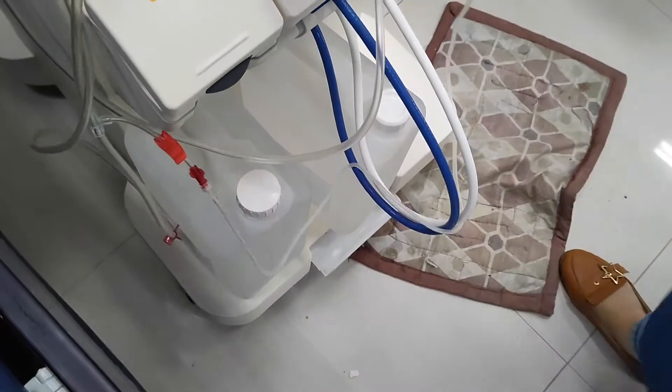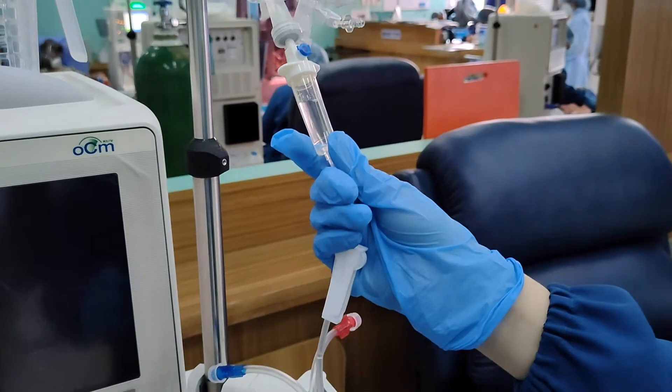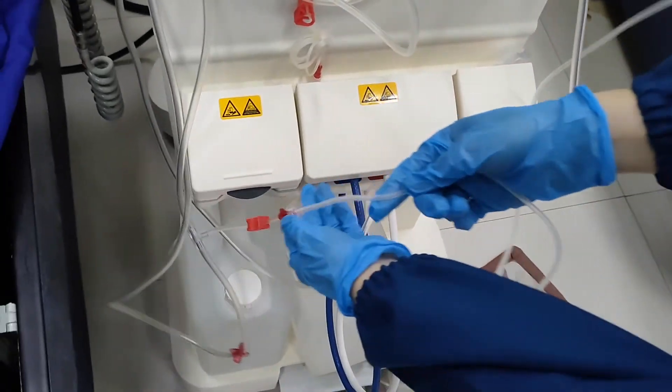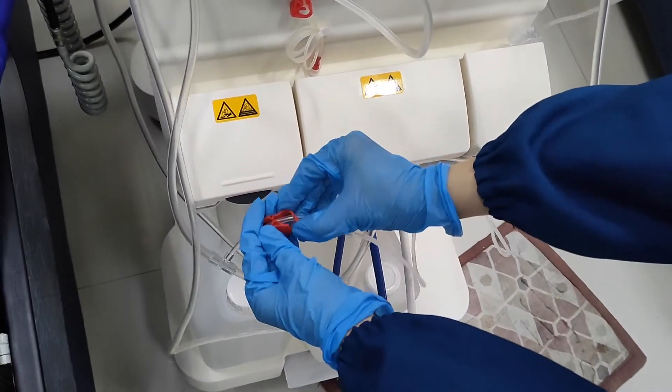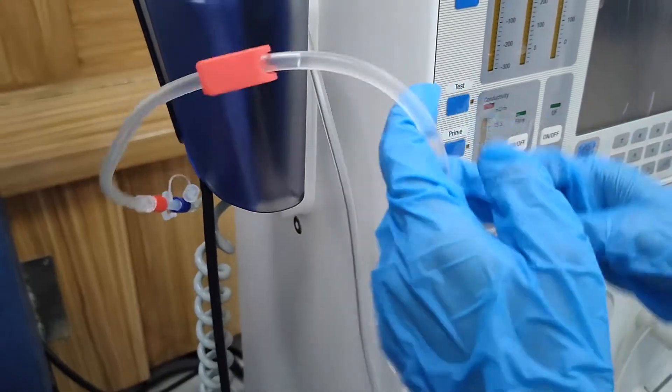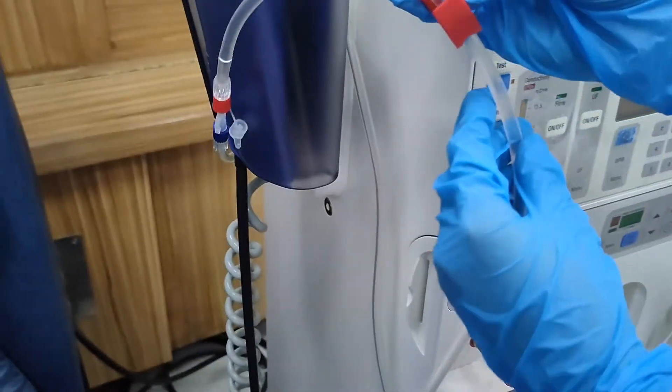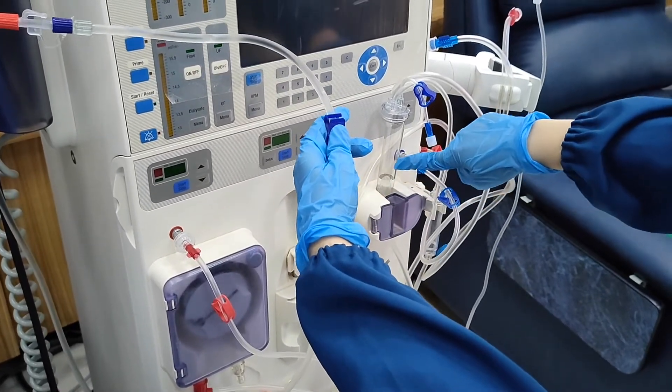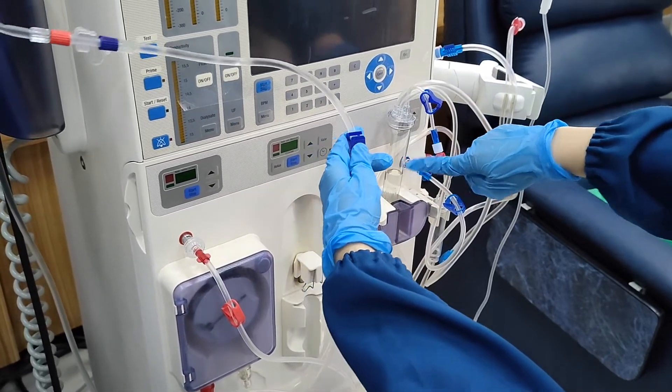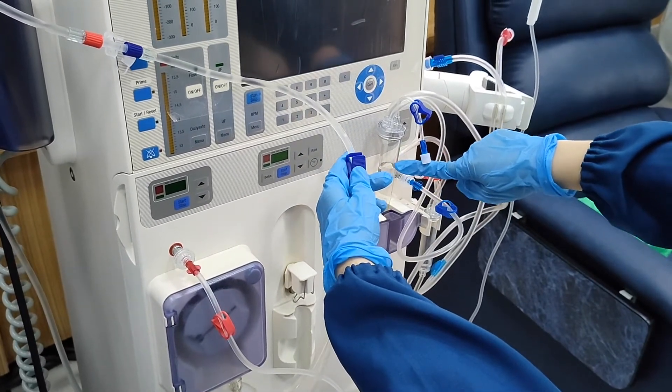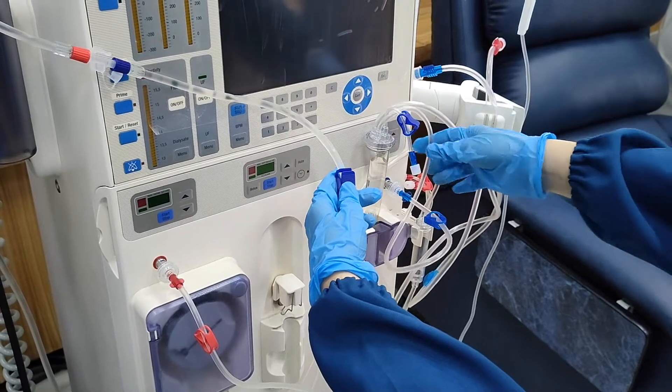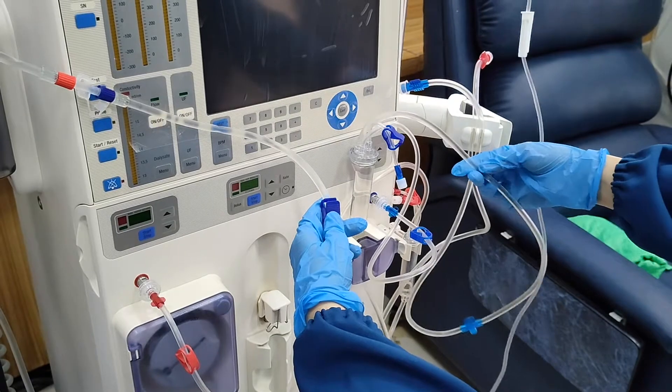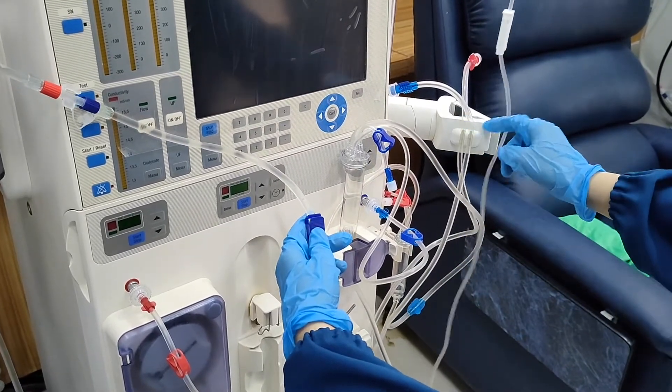Then, open the roller clamp. Then, unclamp the arterial NSS line and fill the venous line and the venous chamber by gravity. Hold the venous clamp and wait for the NSS to fill the venous dialyzer port. Then, clamp it.